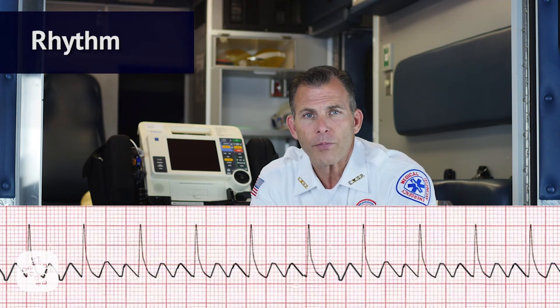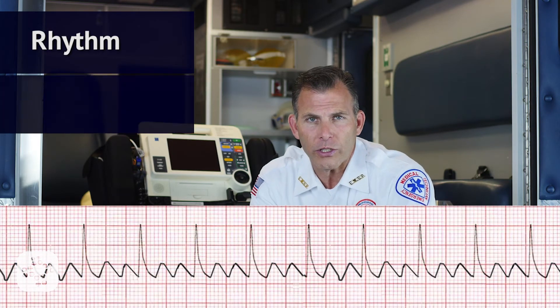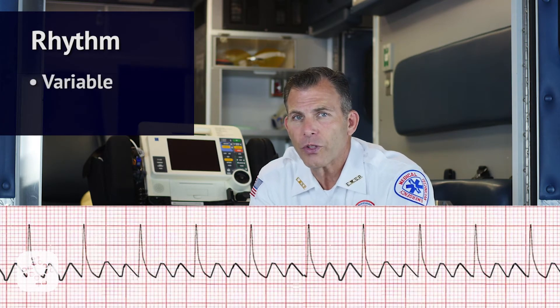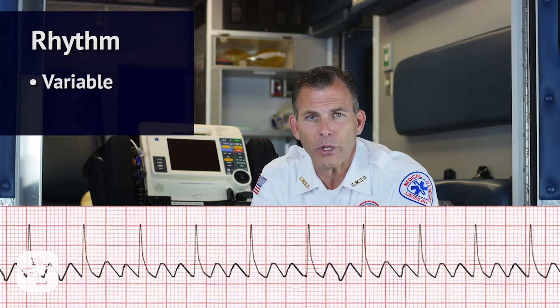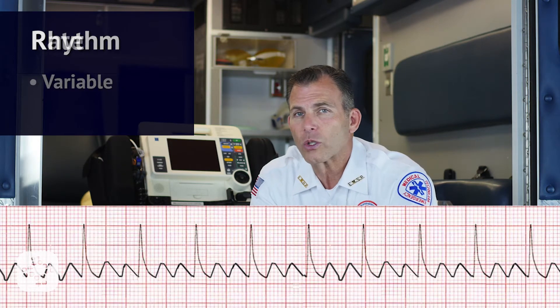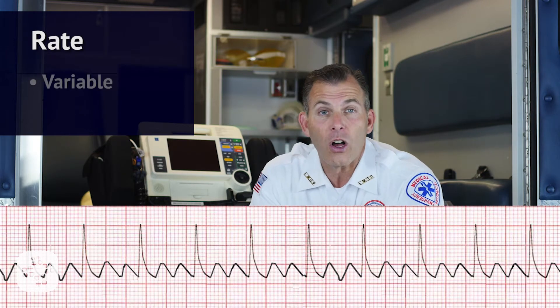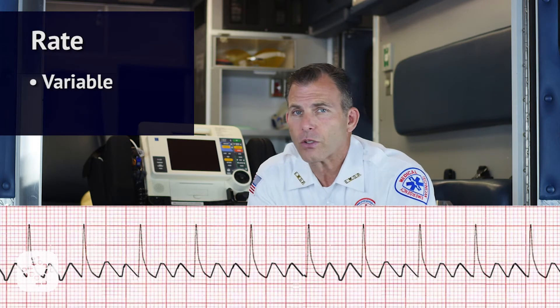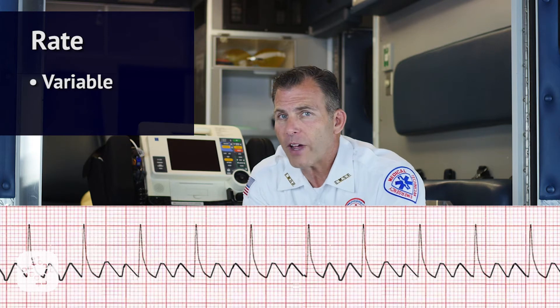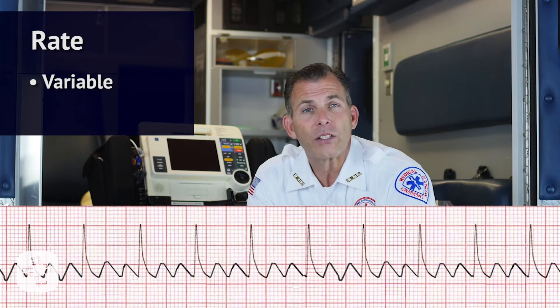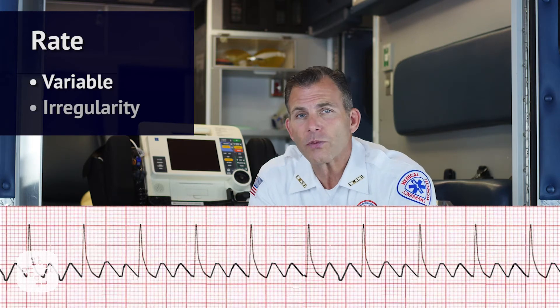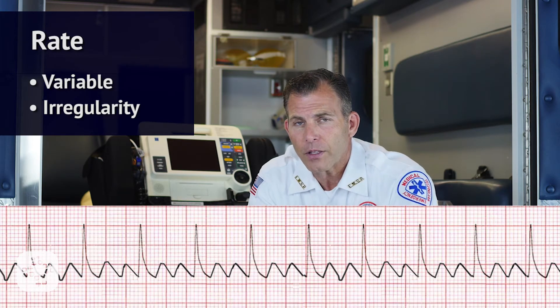Let's take a closer look at the ECG now. Is the rhythm regular or irregular? It's variable depending on the ratio of F waves to QRS complexes. When we look at the rate, what is the rate? The rate is also variable. Is the rate normal, fast, or slow? The rate is variable because of its irregularity.